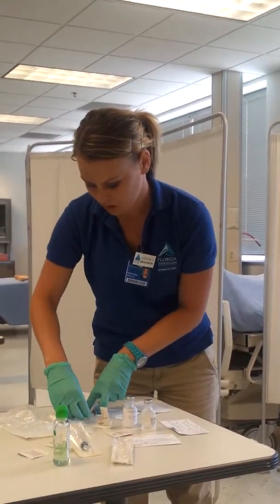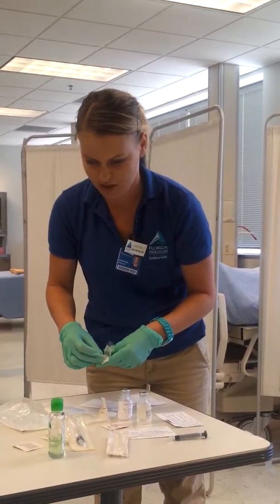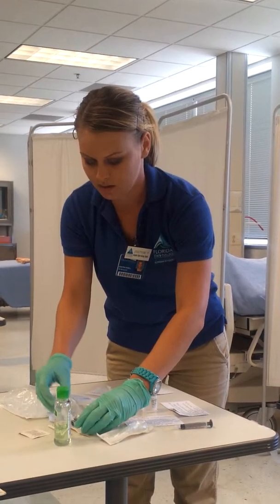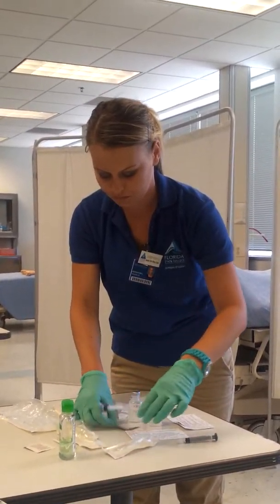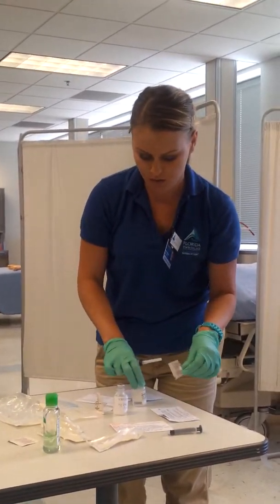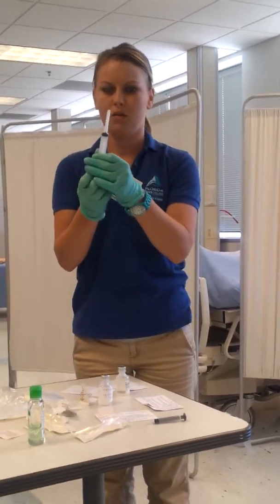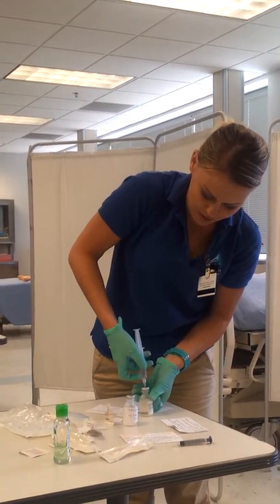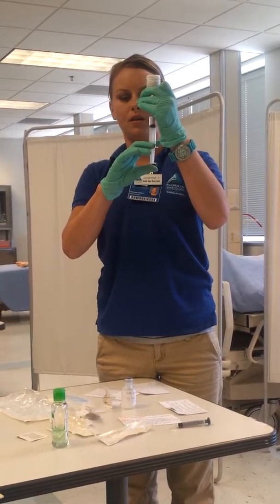Now I'm going to draw up my normal saline so that I can check the patency of my patient's IV. I'm going to get a new blunt tip here and a 10cc syringe. I'm going to clean off the bottle, pull up six milliliters of air, insert this into my sodium chloride, and then pull back six milliliters of sodium chloride.